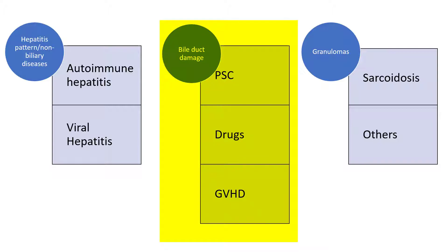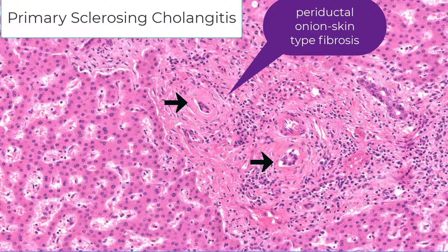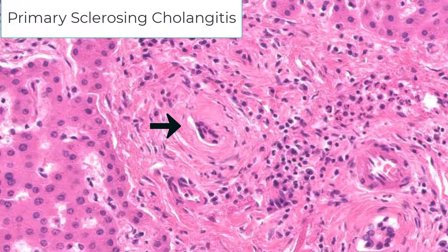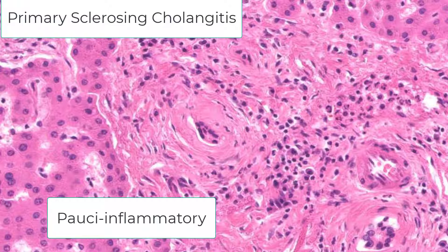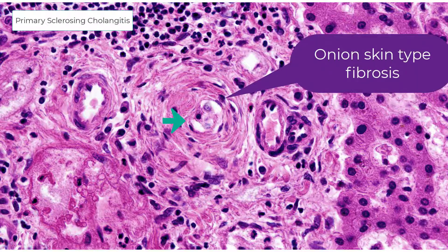The final category is histologic damage to the bile duct. The most discussed in this category is primary sclerosing cholangitis. This is classic PSC — notice the periductal onion-skin type fibrosis. The vast majority of PSC cases will not show this classic onion-skin fibrosis. Also note the damaged bile ducts — these ducts look shriveled up, which is typical of PSC. PSC also tends to be pauci-inflammatory, so you do not see many inflammatory cells in the portal tract, while PBC tends to be much more inflamed. Here's another image of PSC where the bile duct is barely recognizable but the onion-skin fibrosis is present.